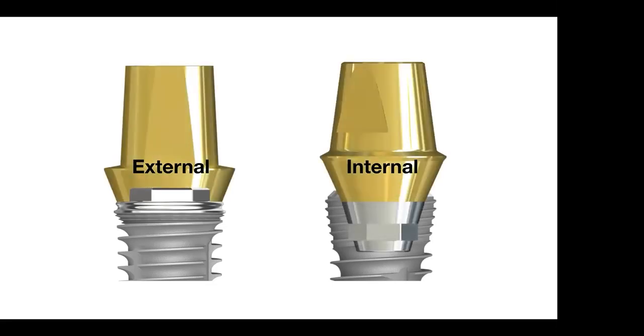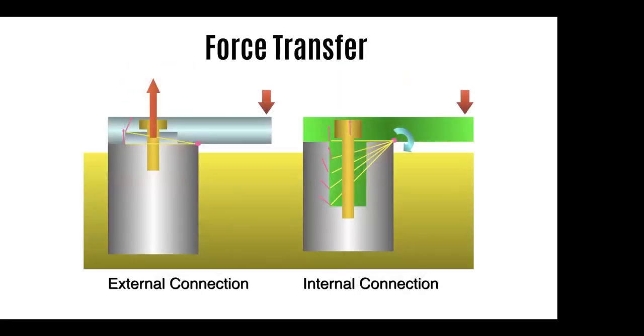With internal connection, it usually goes a little deeper into the implant than the external connection, which sticks up on the top of the implant. This is just the way manufacturers make implants, external connections and internal connections.